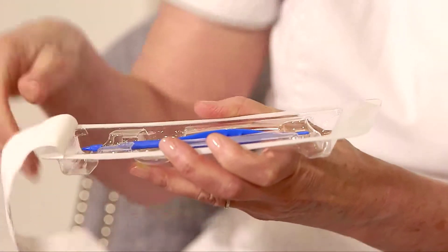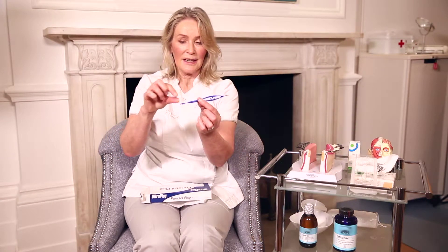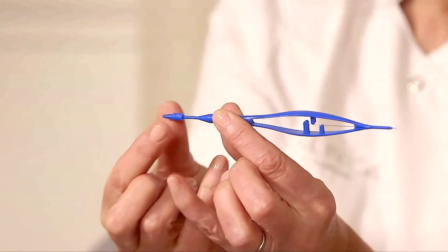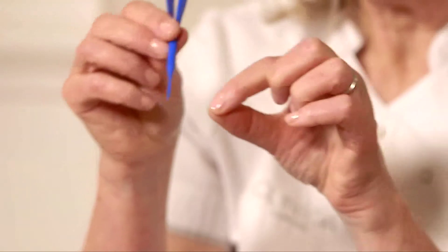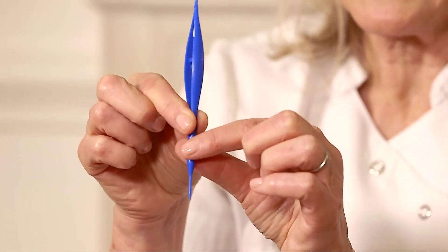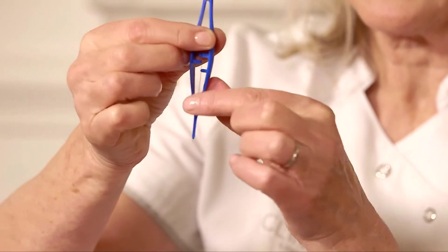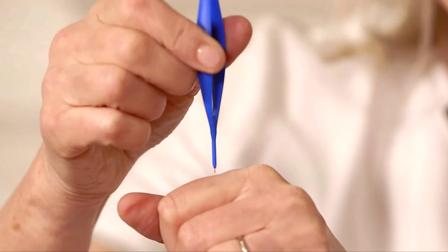This large blue thing is just the introducer. It has two ends. I put topical drops on the eye, then I take that end off. I just stretch the eyelid and pop that in the little punctum that you saw in the diagram. Once that's dilated, I then spin that round and right at the end there — you can barely see it — is a tiny, tiny plug.